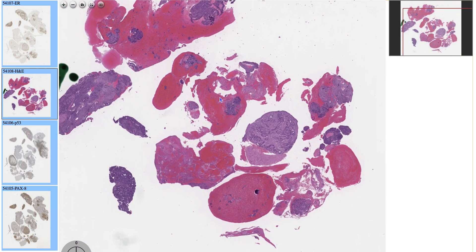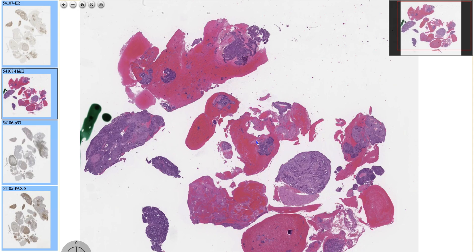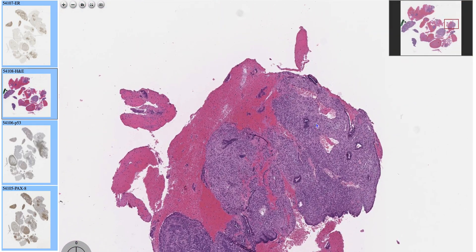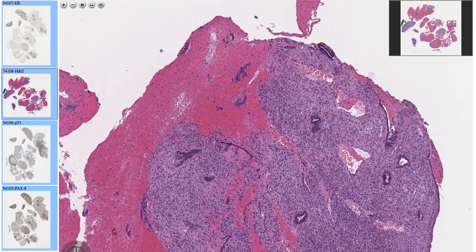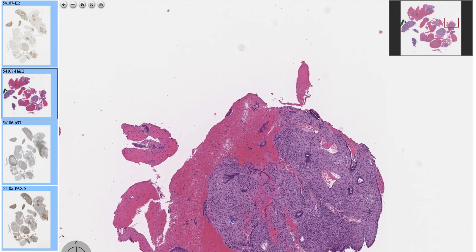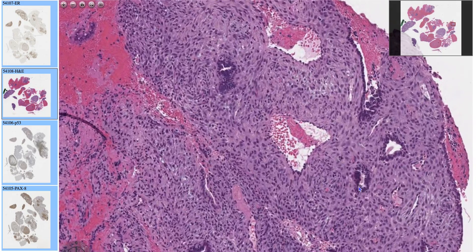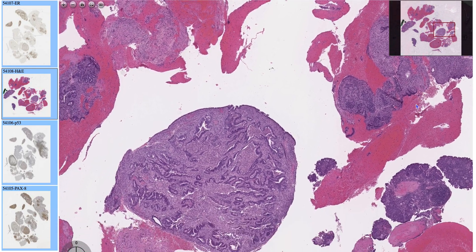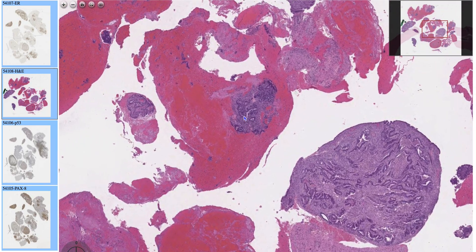Here we have a post-menopausal bleeding and transvaginal ultrasound showed most likely a thickened endometrial stripe. On this endometrial biopsy, the first thing we want to see is the gland stromal ratio. As you can see here, it's less than one — there are fewer glands than stroma. This makes sense because this woman is post-menopausal; the endometrium isn't active and she's not menstruating every month.